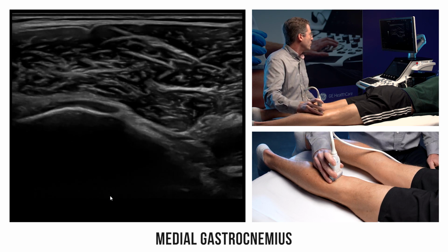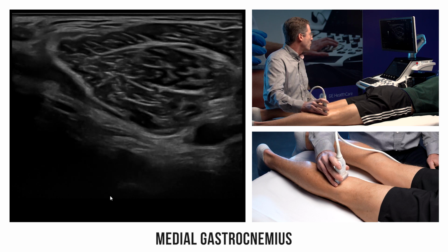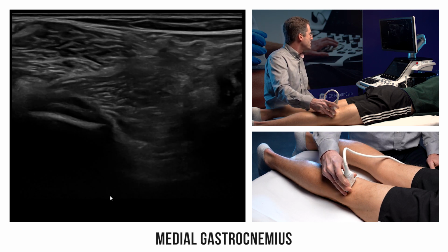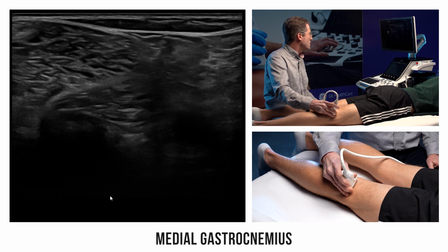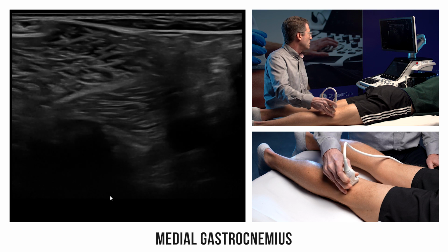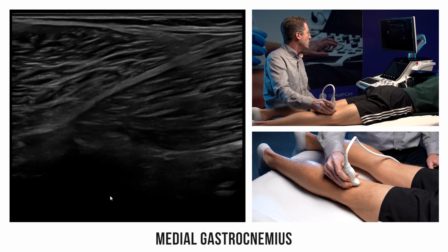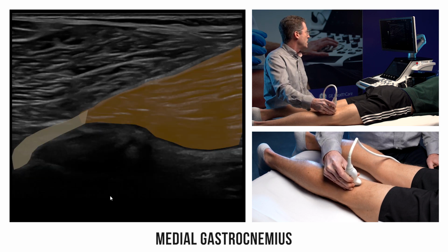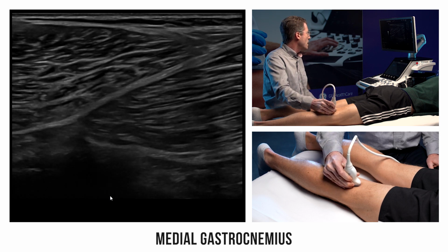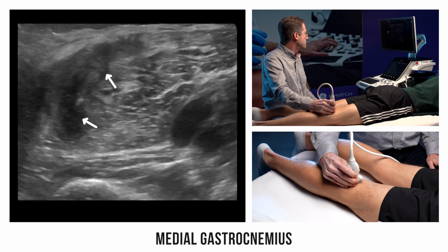If we slide the probe upwards, we can go all the way up to its posterior condylar insertion. Analyzing its insertion is difficult on an axial view, so we rotate the probe 90 degrees to get a sagittal view, making it easier to analyze. Muscle injuries are rare in this area, but should not be overlooked.